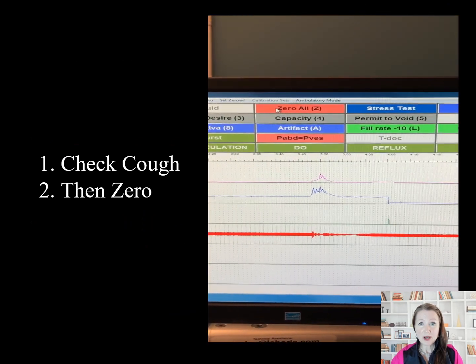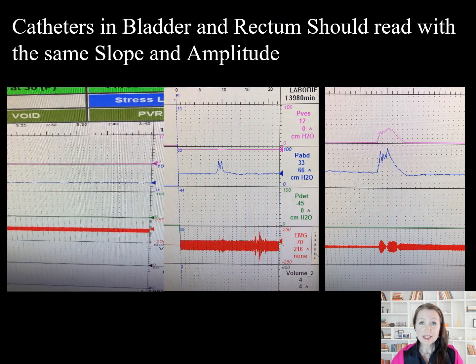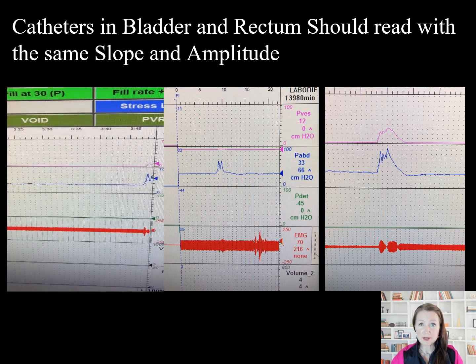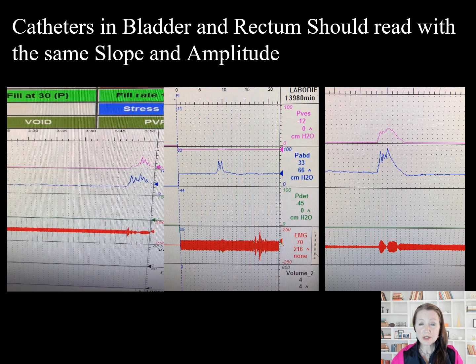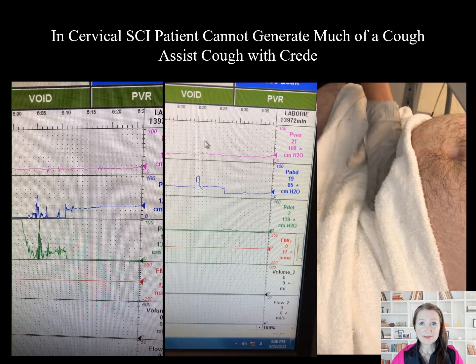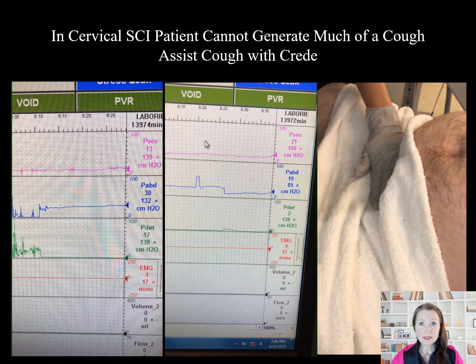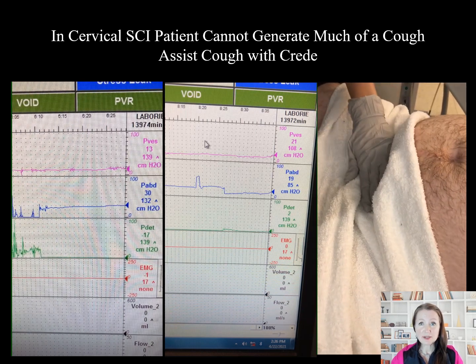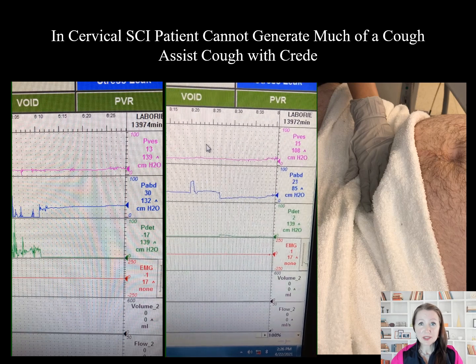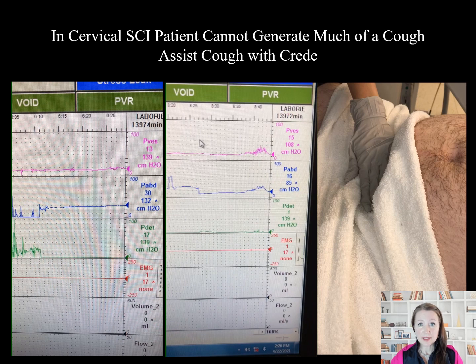Once happy with the cough, we will zero. The tracings on the catheters from the bladder pressure and the rectum should show the same slope and amplitude with cough. Disparities imply something is interfering with the read. In persons with high spinal cord injury, thoracic and abdominal muscles will not generate a great impulse; Credé can be used to assist the impulse. We will troubleshoot until the read is yoked appropriately.